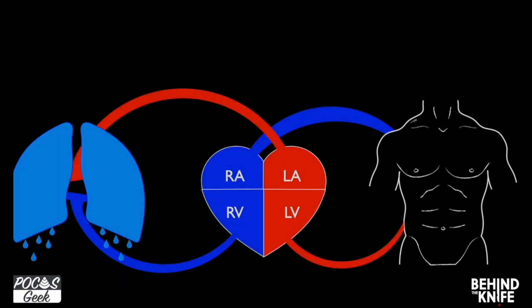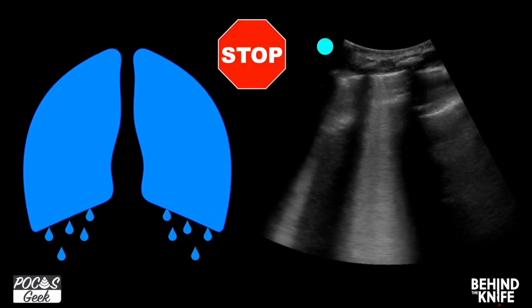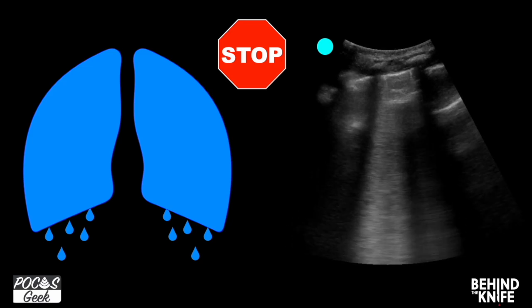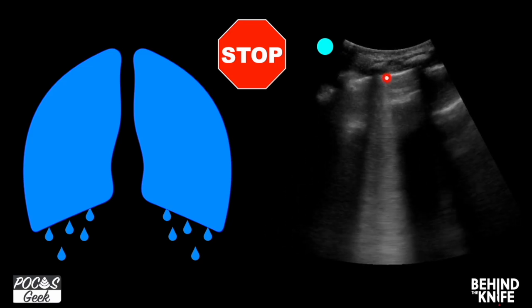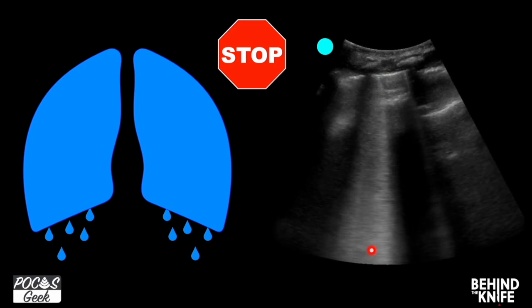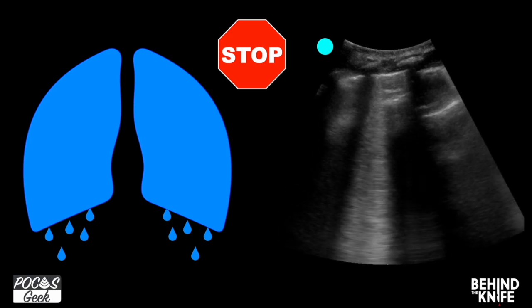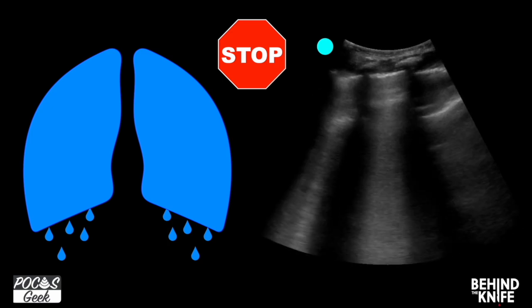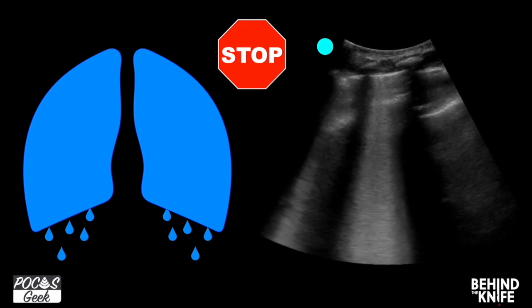What I will say is if you do a lung ultrasound and they are fluid-filled lungs, that there are B lines everywhere, you should not give fluids to these individuals. And this is what it's going to look like. You will have B lines, as we see in the ultrasound, or these bright lines that start at the pleural line right here and go down from there all the way and increase in intensity all the way to the far field. And you'll have those throughout the lung. It's not just in one spot, but it's throughout the lungs. Those patients you shouldn't be giving fluid to.